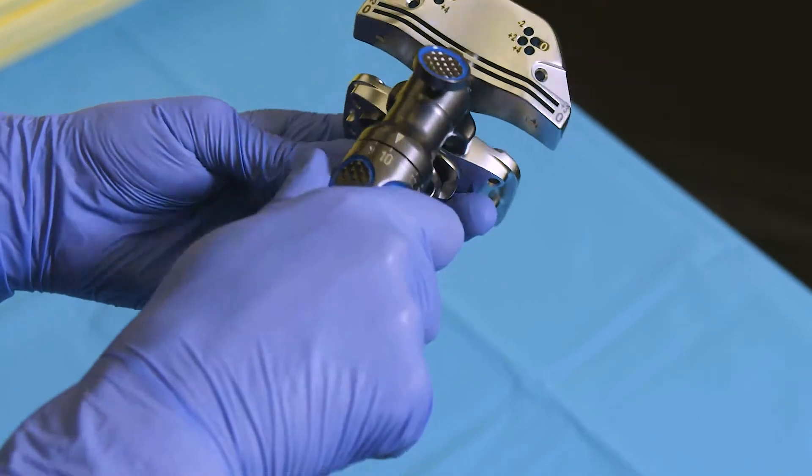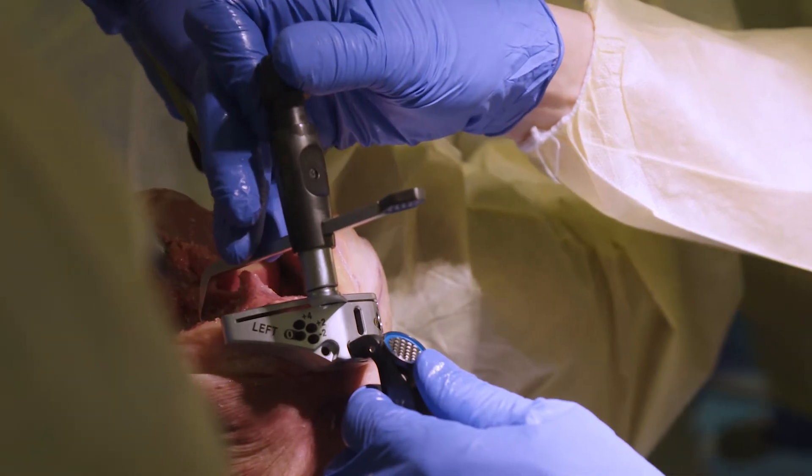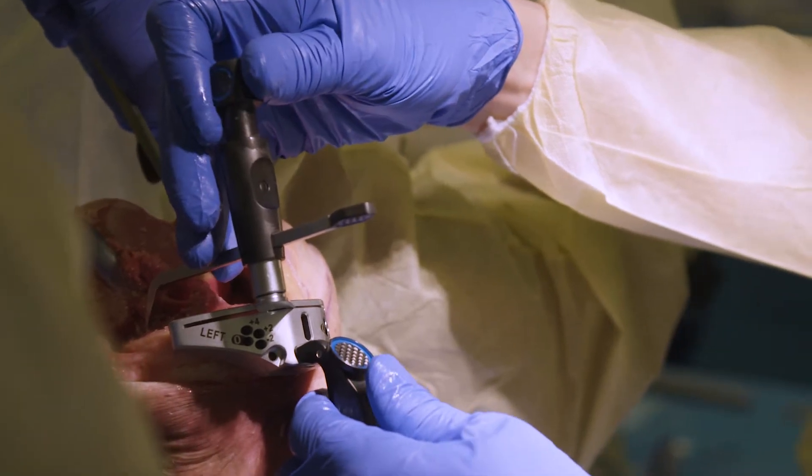But if you look at the color coding, it's very intuitive. So if you've got a new scrub that hasn't worked with you, they can look at the instrument and kind of tell right away — this means I turn this, this means I push this.